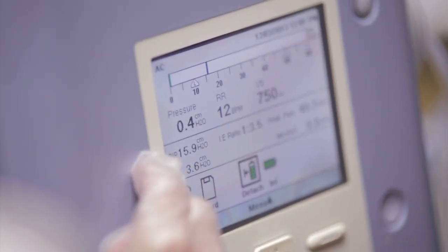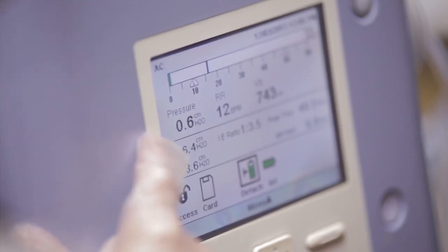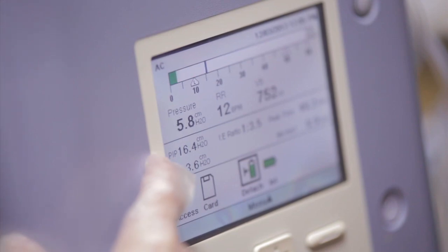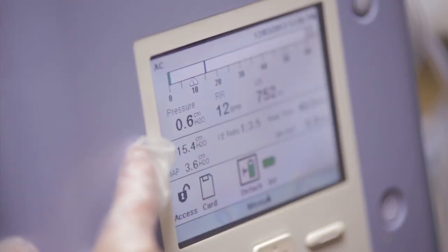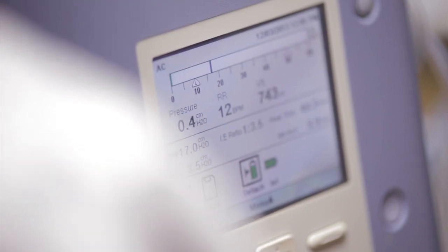Your PIP right now, before we drop the cuff, is at 15.3 — it's a little variable, showing around 16.4 depending on where I'm reading on the scale. You have no PEEP, according to your doctor's recommendations. I'm going to drop your cuff now.